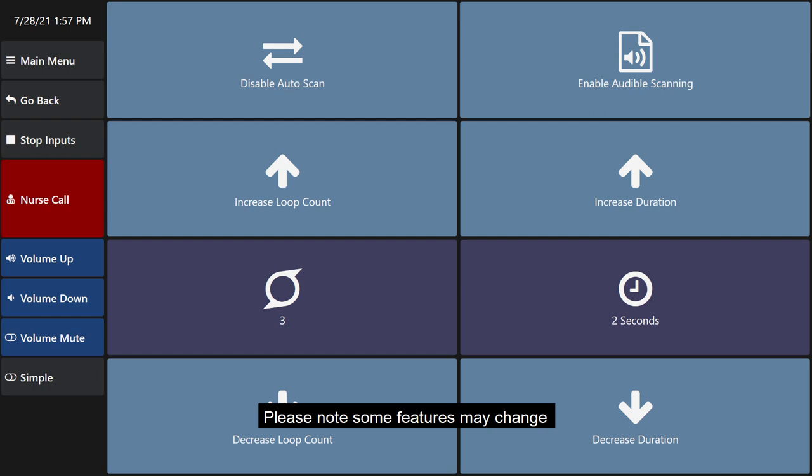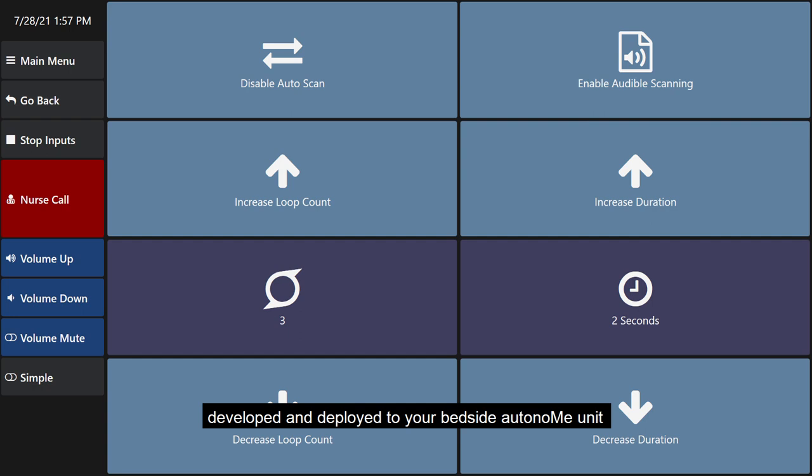Please note, some features may change as our software is continuously being improved, developed, and deployed to your bedside autonomy unit, so things may appear and act different over time.